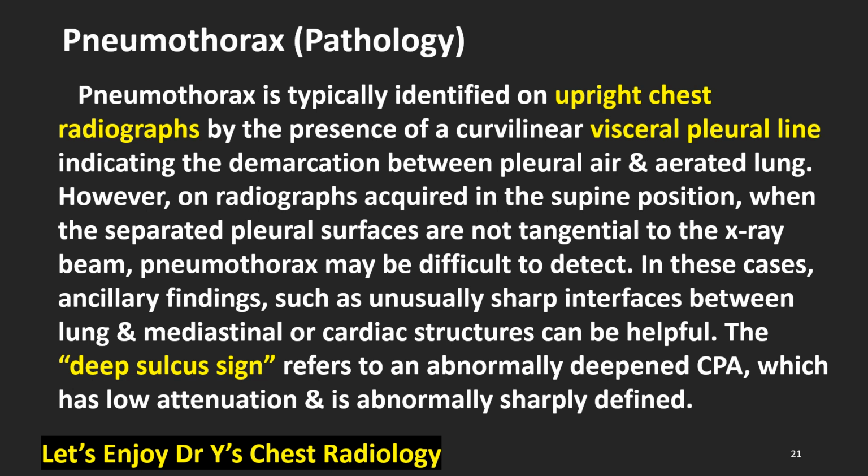However, on radiographs acquired in the supine position, when the separated pleural surfaces are not tangential to the X-ray beam, pneumothorax may be difficult to detect. In these cases, ancillary findings such as an unusually sharp interface between lung and mediastinal or cardiac structure can be helpful.